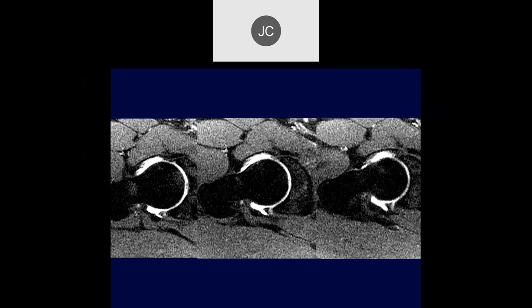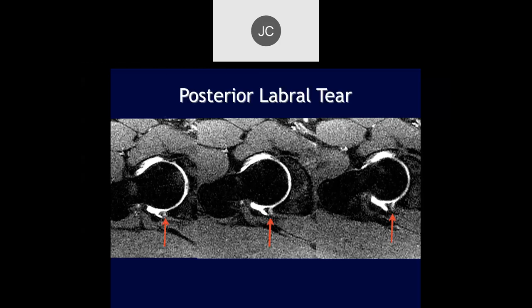Tason — this is a very old arthrogram. The posterior labrum looks like there's probably a tear there — not quite linear like the sulcus pictures. The margins are not sharp. We don't really see fluid going into a typical sulcus. This is more increasing intensity within the labrum because it's abnormal, with contrast kind of oozing into the soft tissues of the labrum. This was confirmed as a tear, even without a paralabral cyst.